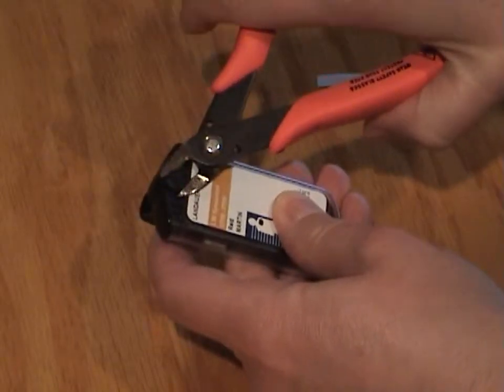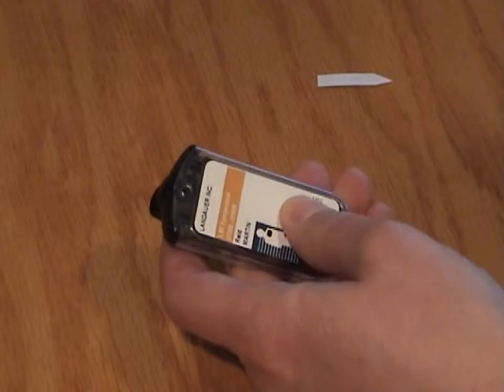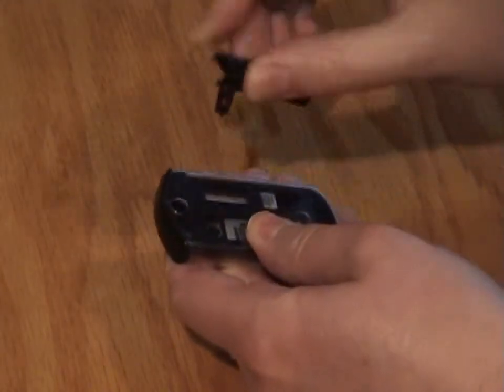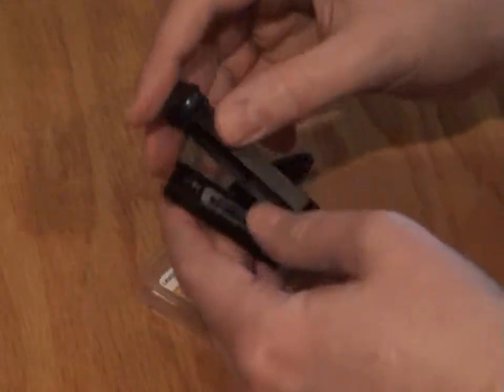To remove a dosimeter from the InLight style holder, clip off the security pin from the front of the badge. Remove the holder clip from the back, then remove the carrier from the cover. The dosimeter is then easily removed from its carrier.